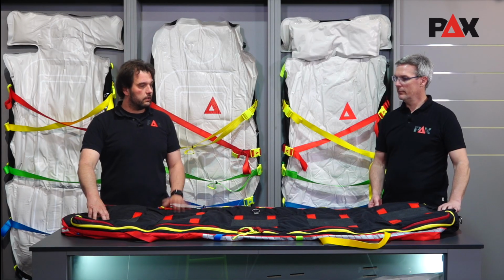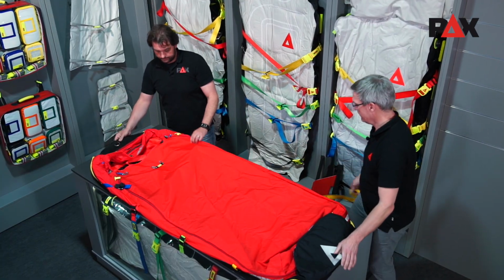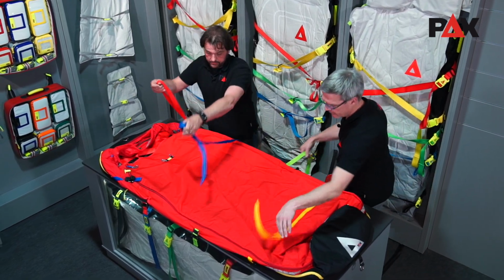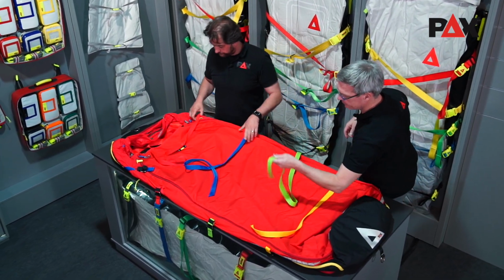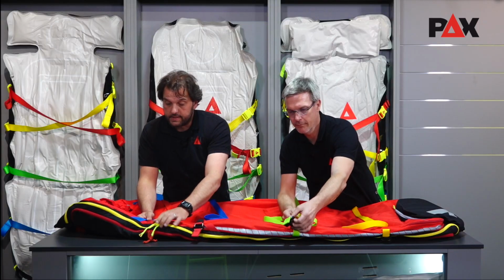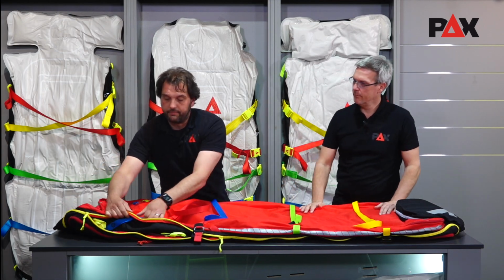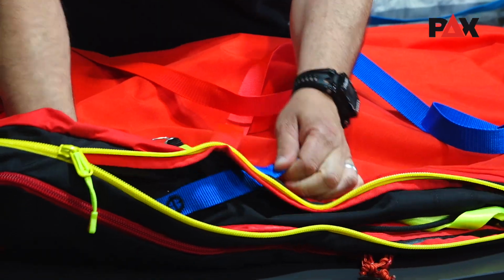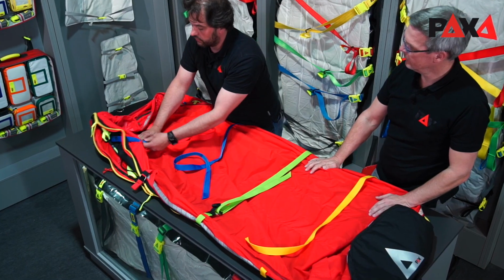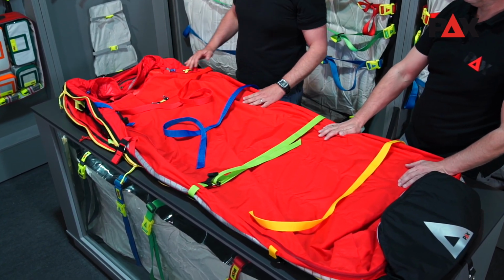Now that we had a closer look at the bottom of the rescue bag, we can turn it back again and we can have a closer look at the compression straps that are here for securing the patient. One important thing is that there is no force of the compression strap that is introduced into the zippers. So all the force goes down to the bottom of the bag and the zippers are not involved in that force.